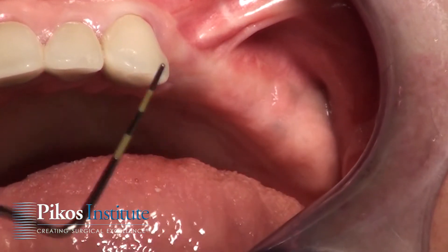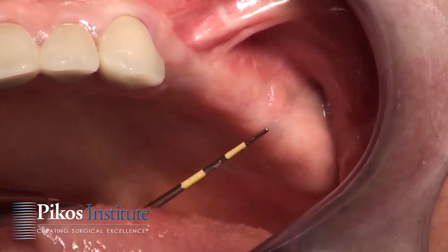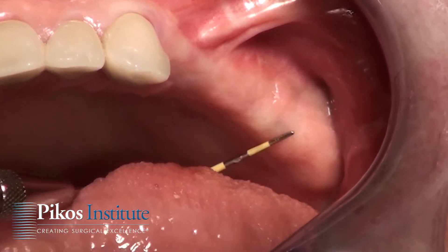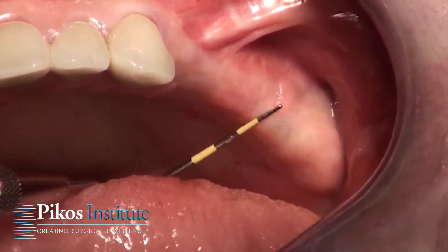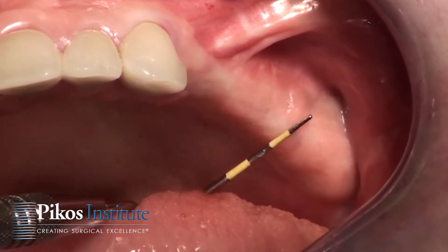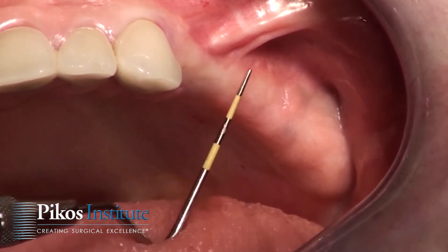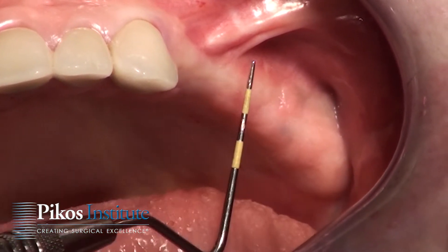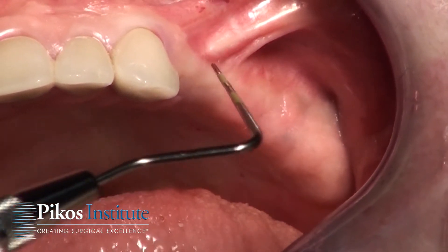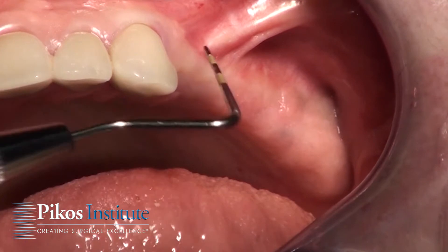So this is what things look like clinically. As you see, this ridge is relatively narrow, even from a clinical perspective — again, Division B, almost a C-W. But at any rate, we have good attached tissue, good keratinized tissue, a little bit of a muscle pull right in here. Our phenotype is more or less a thick phenotype.